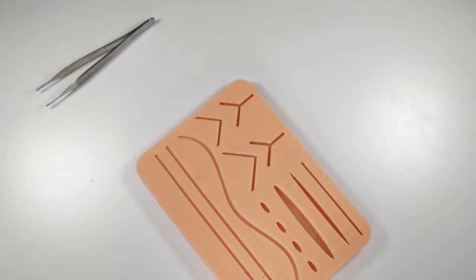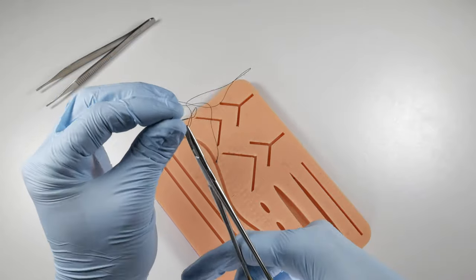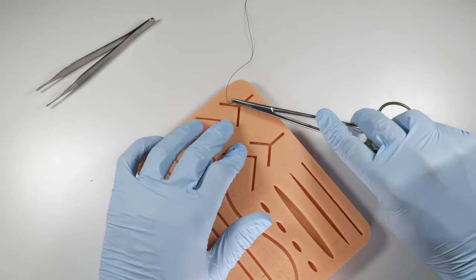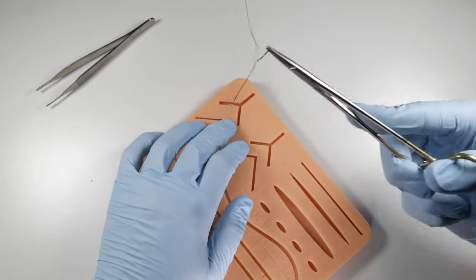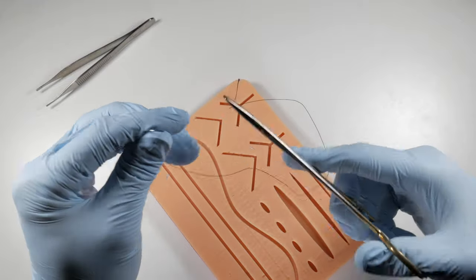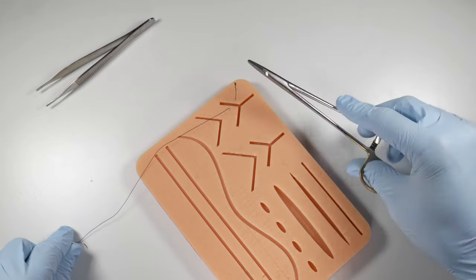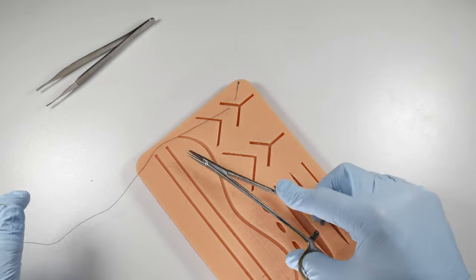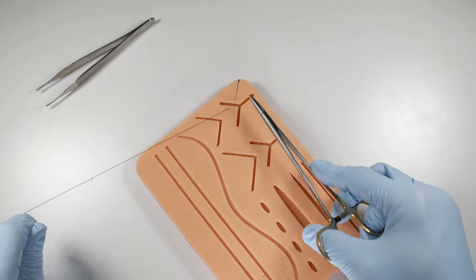Anytime that you place a suture and you're leaving that little tail on the end there, one nice thing to do would be to have your assistant basically suctioning on the small end or the short end that's there. So let's say that we throw this through the tissue here. We've got one thin small end here and we're going to have our assistant holding this with a surgical suction and it basically just rattles around in that suction until you're ready to grab it.